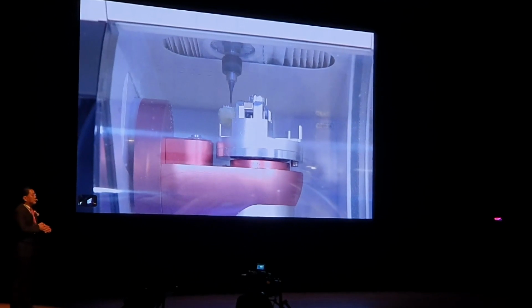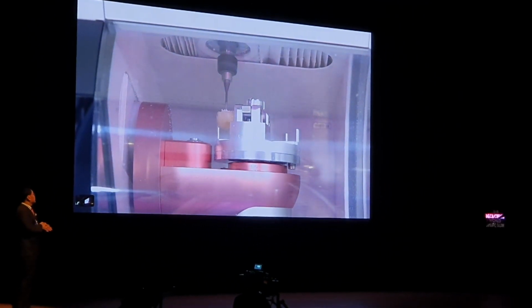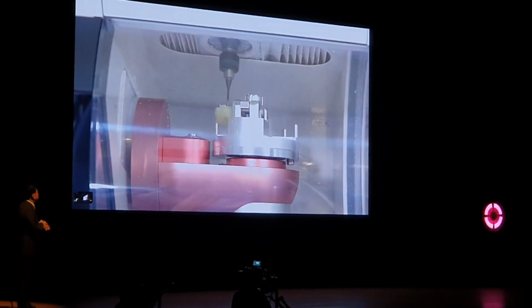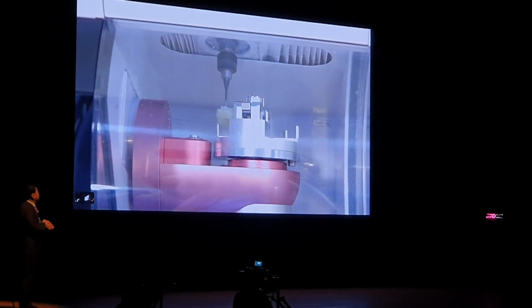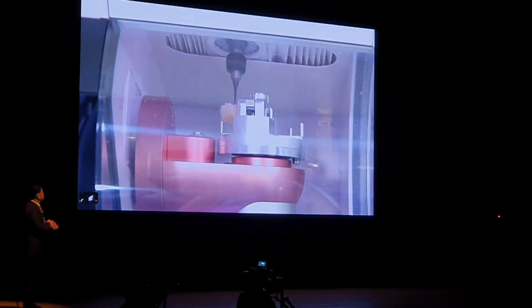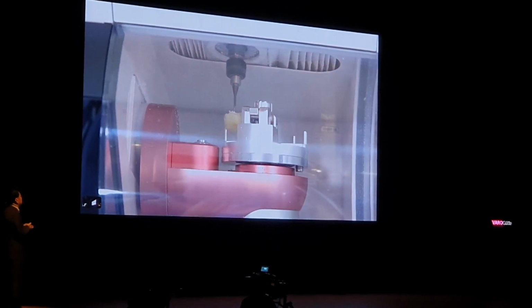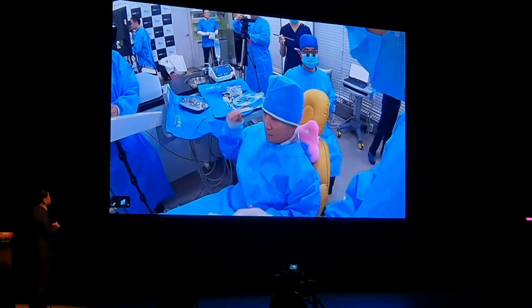Alright, let's get ready. I need a mirror, big size mirror here. So we'll be placing a 5mm in diameter and 10mm long implant. So be prepared for sinus lift and bone graft. Bone graft for about 3 times with the SCA bone carrier. And let's do it like usual surgery. So yes, the sinus will be elevated about 1 or 2mm and then sinus graft.